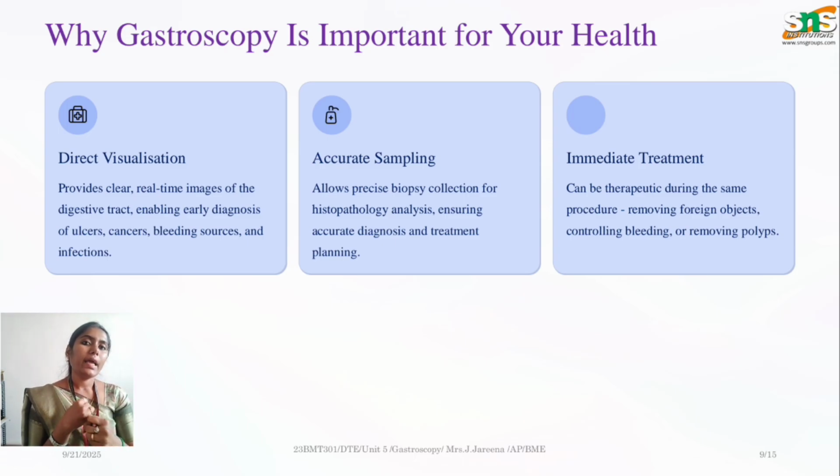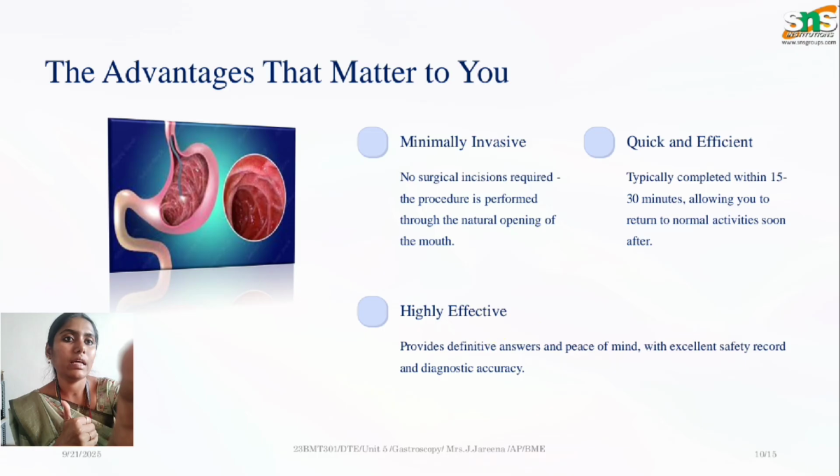The second one is that we have so many benefits, because gastroscopy is minimally invasive, which enables direct visualization, and we can do a biopsy, which helps to take accurate sampling only from the targeted area. Once everything is done in the same procedure, on the same day we can start the treatment. So immediate treatment leads to immediate recovery from that problem. This is how gastroscopy has a very important impact on a patient's health and life.